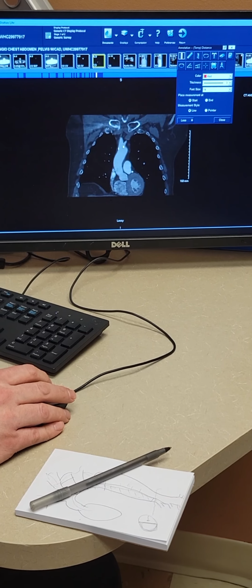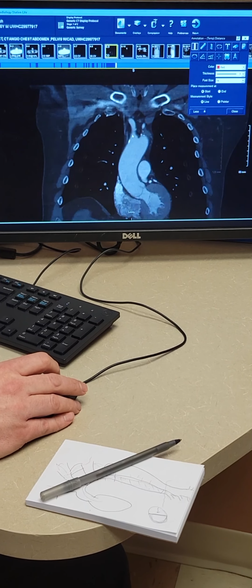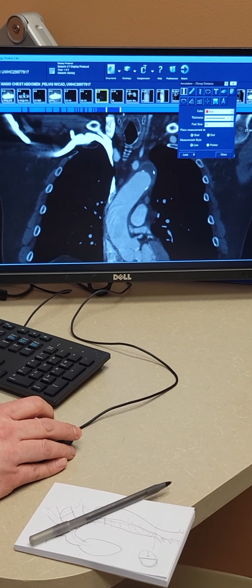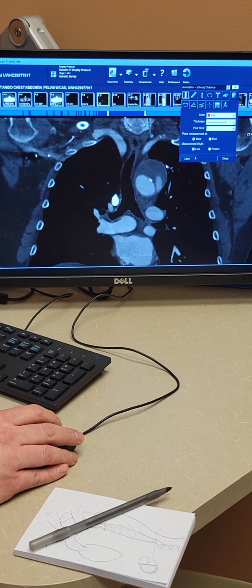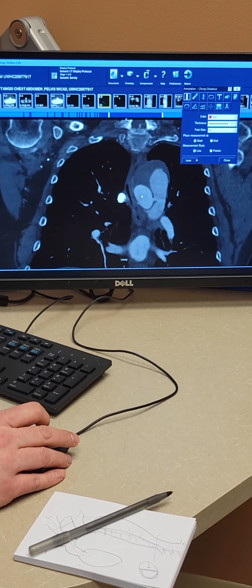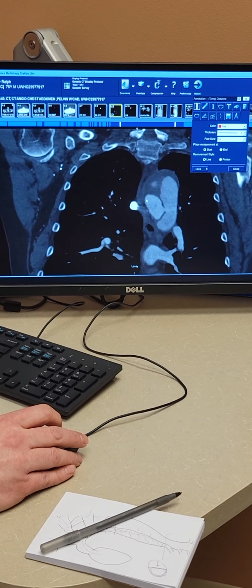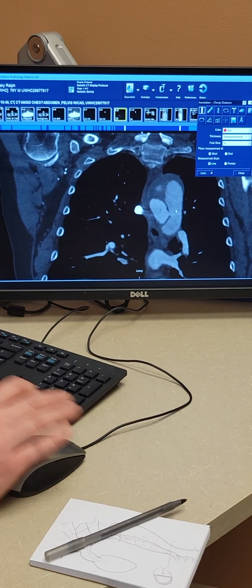So again, here's where that left carotid, that right side is. Make it bigger. This is the artery to the left arm, the left subclavian, and then there's that hump of the dissection there. So this area here is the false lumen. And like you can see there, there's that connection. And so what we want to do is stop up these connections, have all the blood go through the stent that we're going to put here so that the pressure's taken off. I understand.